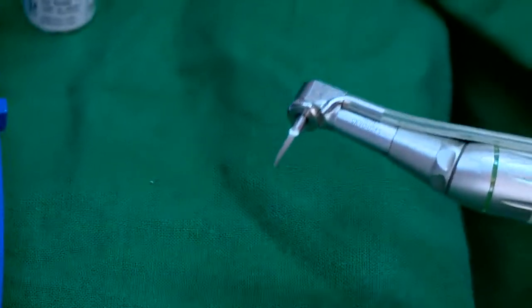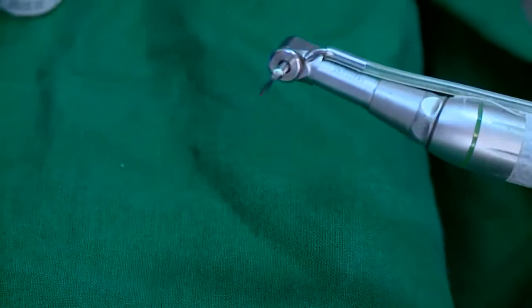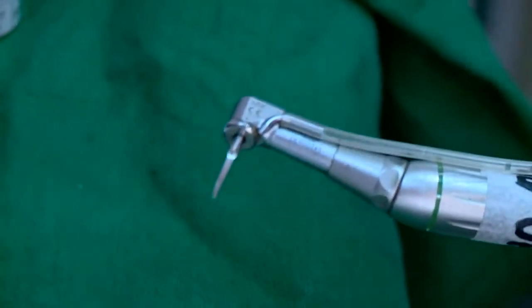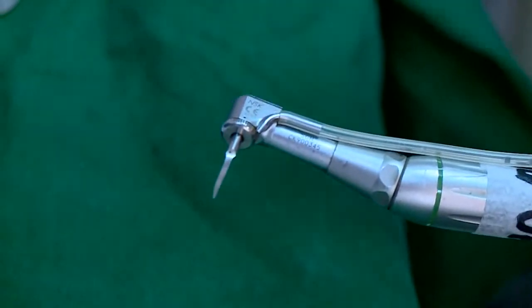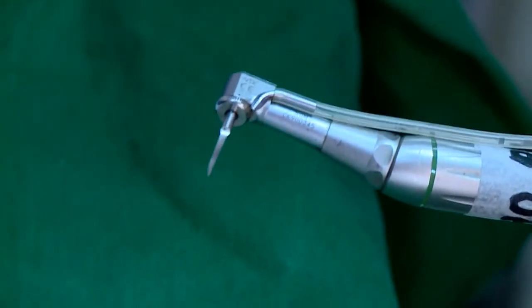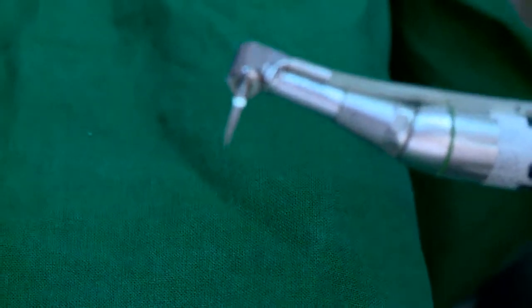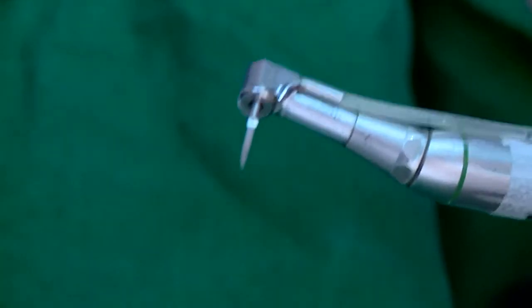Right? Now this is a very sharp drill, as you see. This gives you the initial purchase. After that, we go through what we call sequential drilling. We have to go progressively, increasing the size of your osteotomy site step by step.